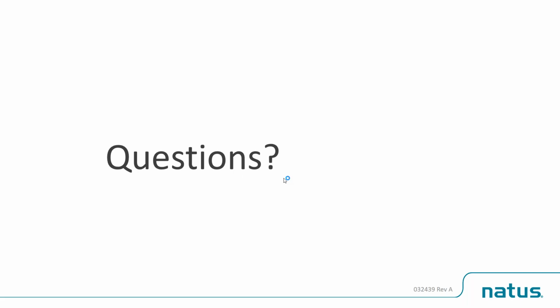All right. Thank you again, Jim. And we have here, what is triple stimulation? So triple stimulation is where we want to do the collision study distally, and then the third stimulation is actually a cortical stimulation.